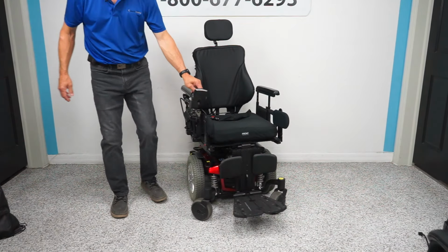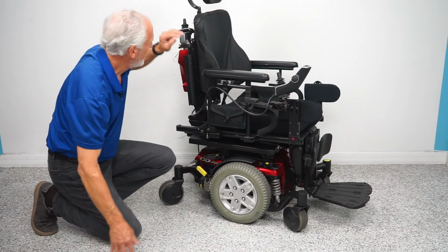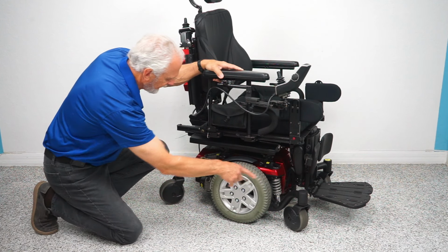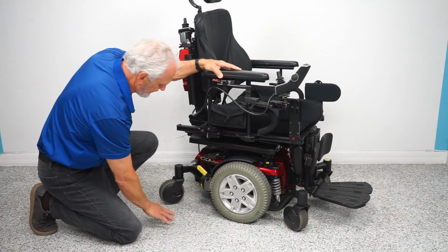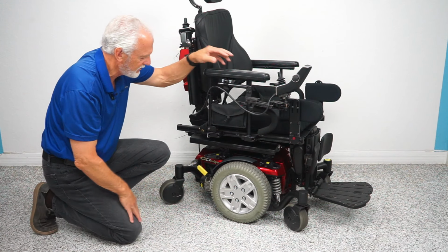Okay? Let's look at the base before we look at the seat. So this chair, as I said, has 14-inch tires. They're not going to mark your floor. Same with the front and back. When you have a mid-wheel drive, where this is a mid-wheel, you're always going to have a tire in the front on the ground and one on the ground in the back to keep the stability and help you have that nice turning radius. Okay?